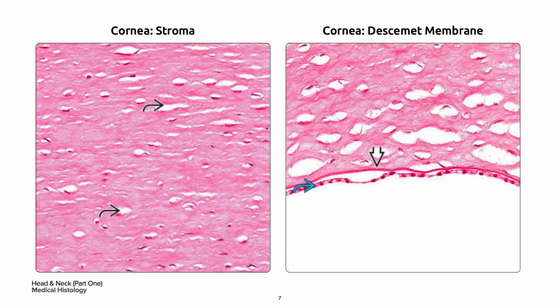On your left is the corneal stroma, which is composed of regularly spaced collagen fibers embedded in an extracellular matrix. Of note, there are no blood vessels or lymphatics present in the corneal stroma. The cleft-like spaces in the curved black arrow are secondary to tissue fixation and processing.